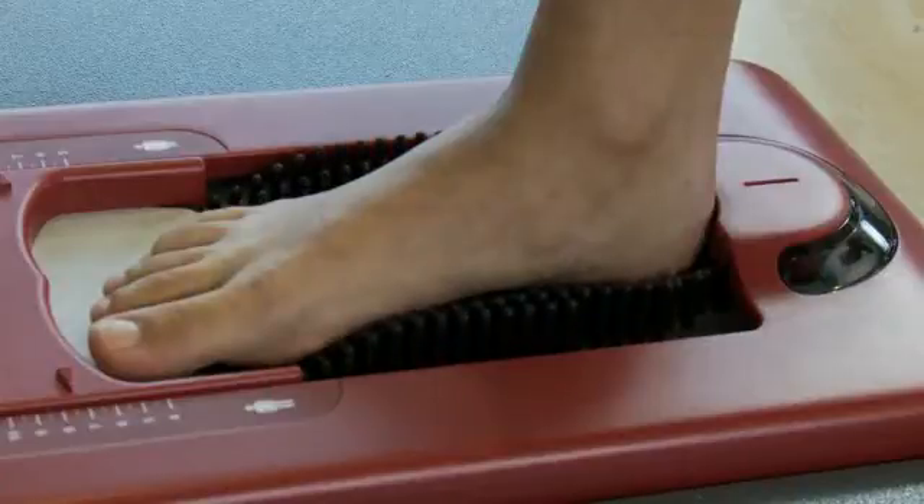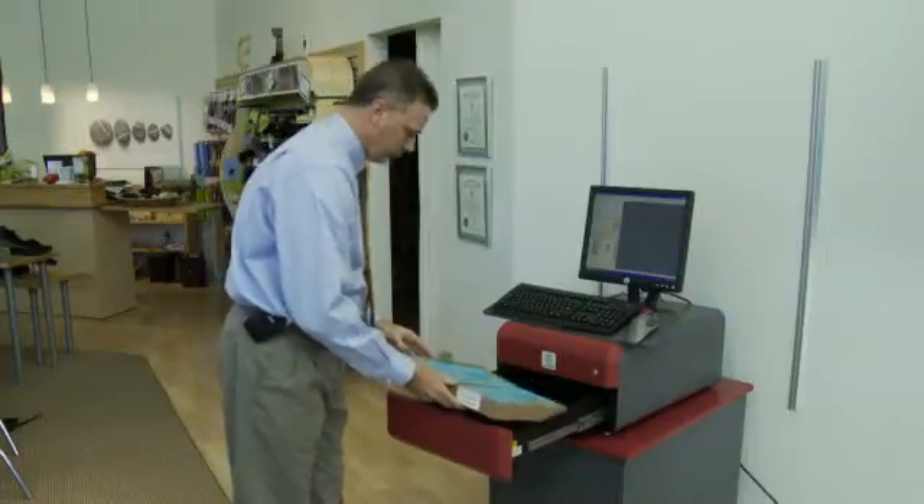Scan your patient's foot with our contact digitizer, or take a foam box impression and scan that with our impress scanner, or simply send the box back to our facility.